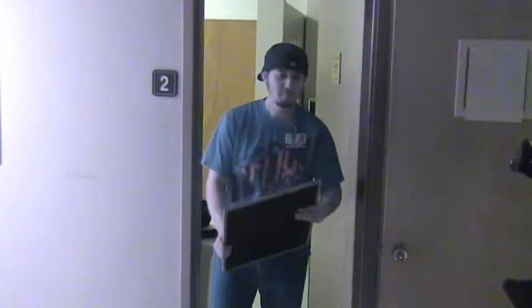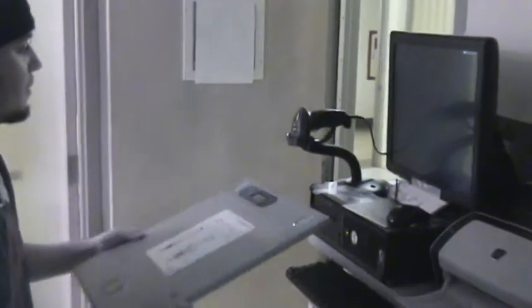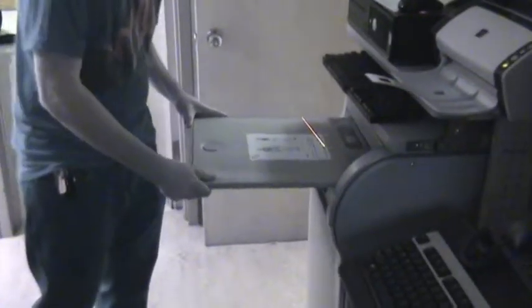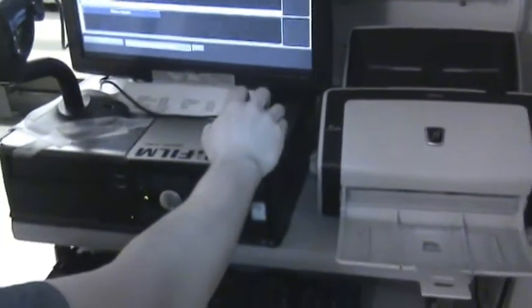Now after each exam that is completed, we will bring the cassette over to the reader. We will find the barcode in back of each cassette. We will scan the cassette. Then once the beep, we will put the cassette inside the reader. Then what the reader will do is bring up the image on the monitor. Then from there we critique.